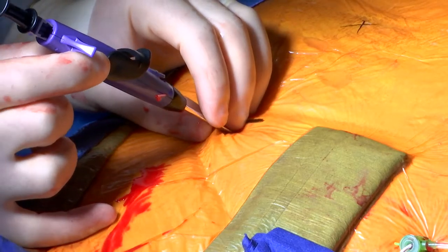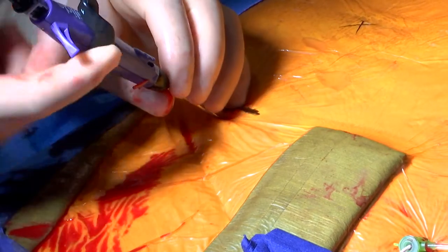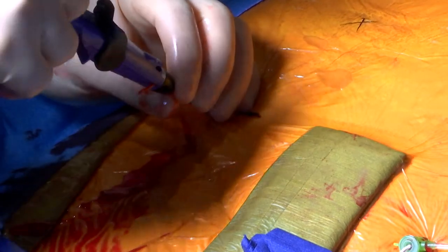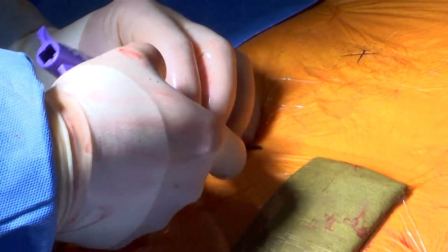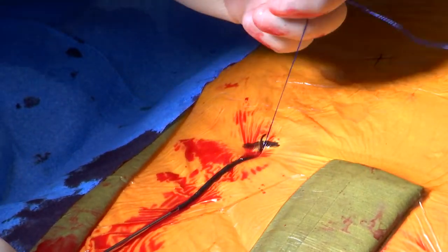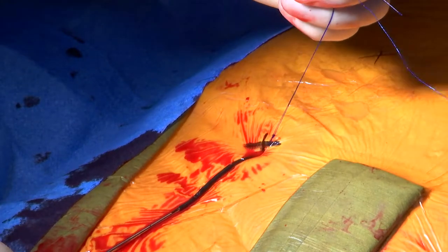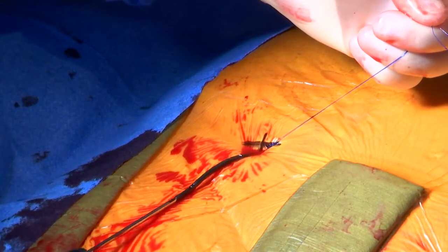Pull it back. There's no flow. Go back in. Rotate it slightly away from me. Open the foot plate. Pull it back and deploy it. And what that does is it puts a suture through the artery, and it has a pre-tied knot on it, kind of like a noose. And that's going to be attached to the artery. I'm going to pull the slack out of it, and that suture is going to stay there so that when we take the sheath out at the end of the case, we use that to cinch down on the artery. Just hold that for me real quick.